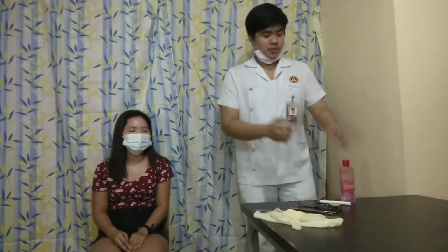Okay. Thank you, ma'am. After that, I am now going to perform my hand hygiene and observe other appropriate infection control procedures. Performing hand hygiene is to prevent the spread of infection. After that, I am now going to assemble all my equipment and supplies. So I have here a pair of clean gloves, ruler, the tuning fork, watch with hands, and of course an otoscope or pen light. We need to provide for our client's privacy also by drawing the curtain and closing the door in the room.